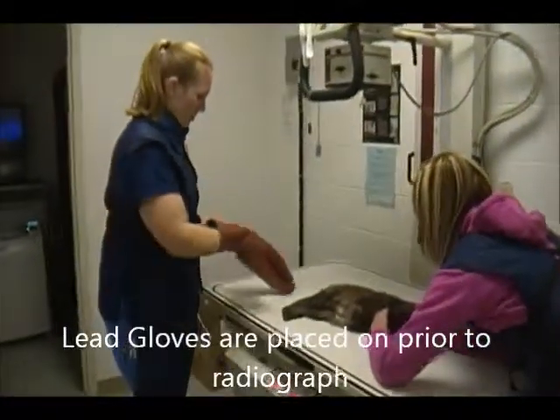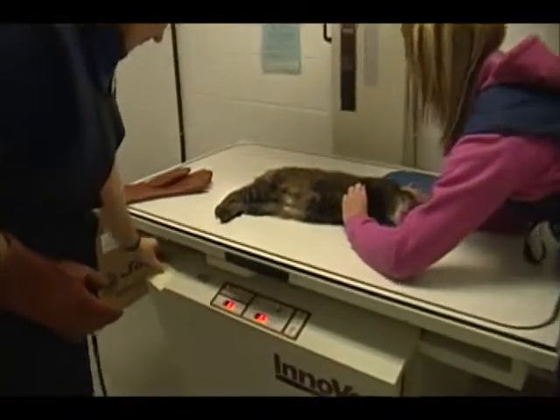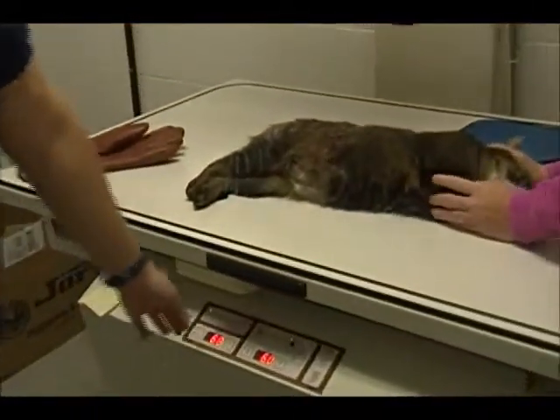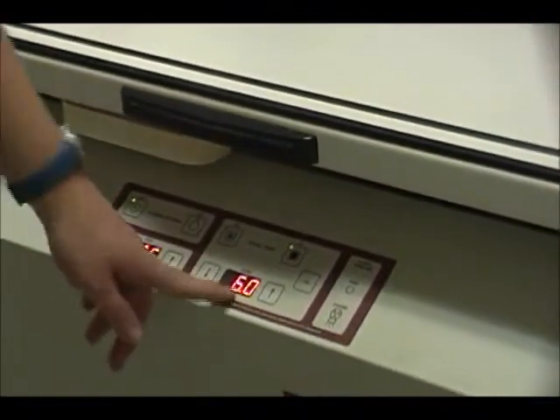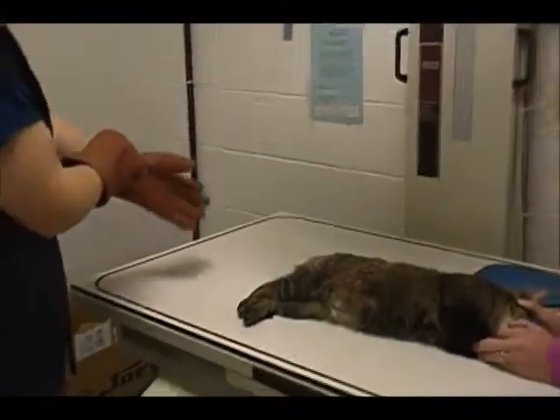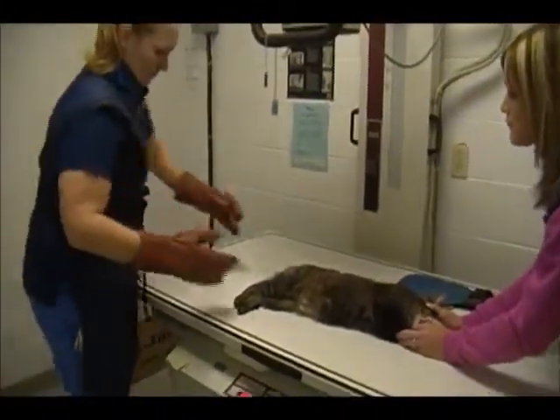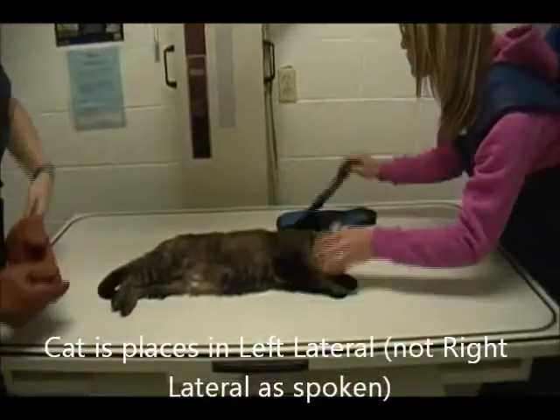So for 11 cm, we're going to be at 66 kVp and 6.0 mAs — we've already adjusted here. And we're going to do our right lateral first.